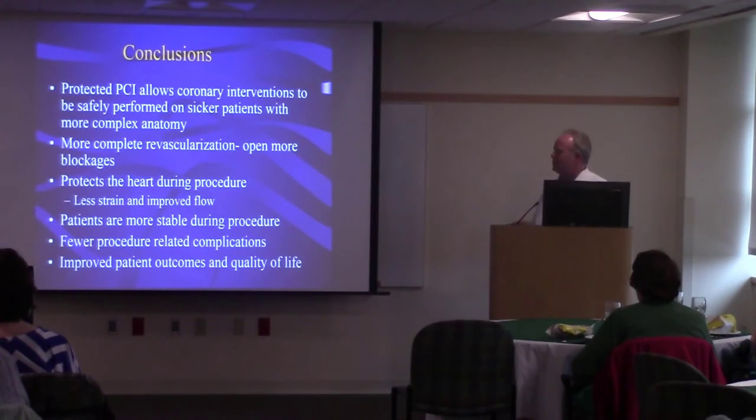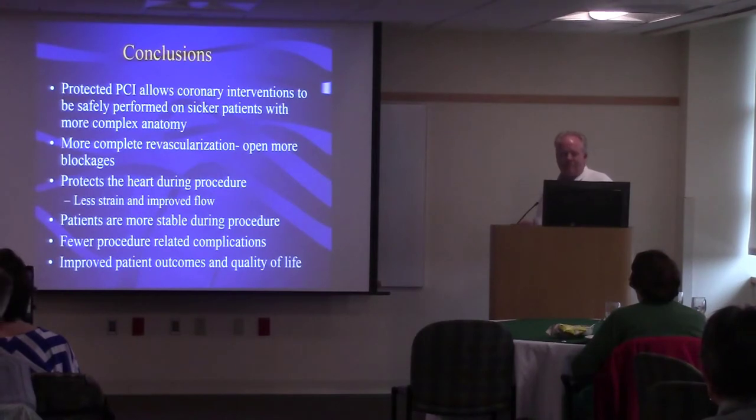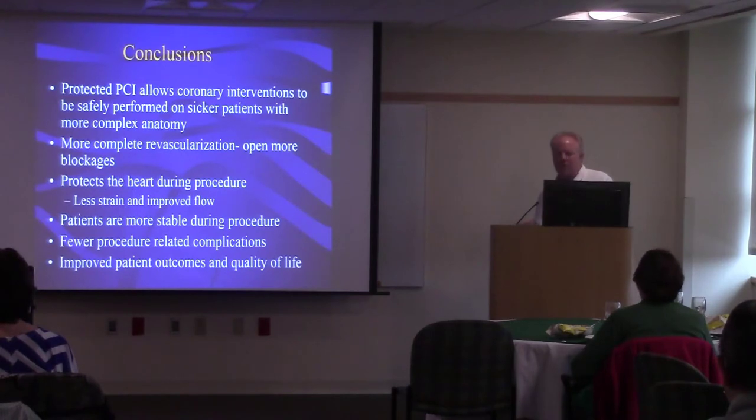So in conclusion, the Protected PCI allows us to do coronary interventions safely. We can do this procedure on sicker patients who we wouldn't otherwise be able to do a procedure on. It allows us to work on more complex patients with complex anatomy, and patients who are not surgical candidates, and patients who really wouldn't have any other options if it wasn't for this device and this program.